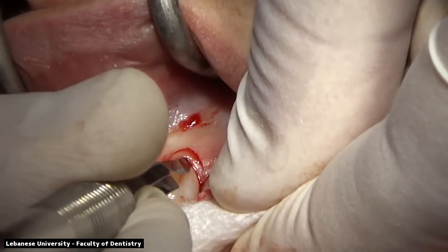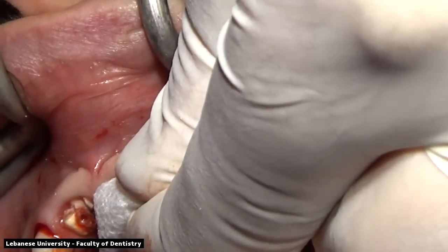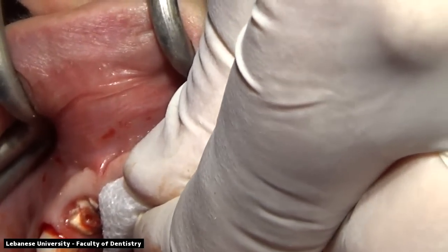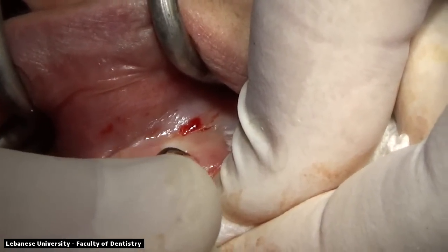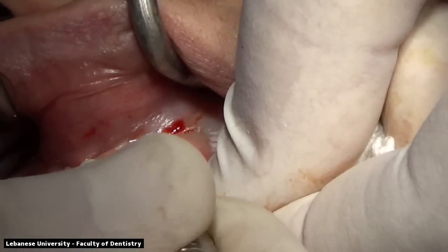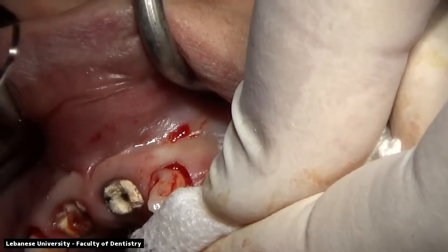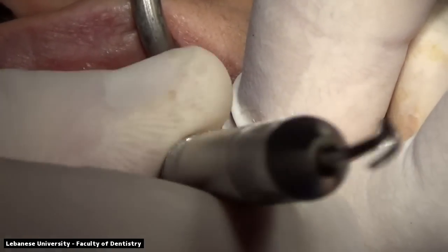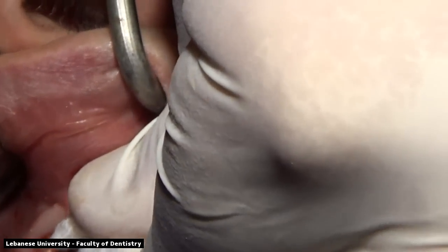So now we're going back to the intrasulcular incision to dissect this tissue and remove it without any tension. We did the intrasulcular incision again, and it will allow us to remove this tissue without any dehiscence or any fibrous tissue attachment.